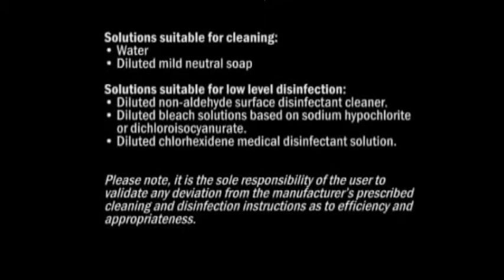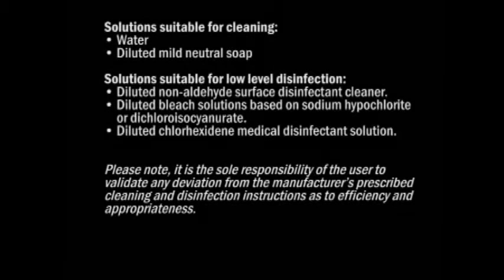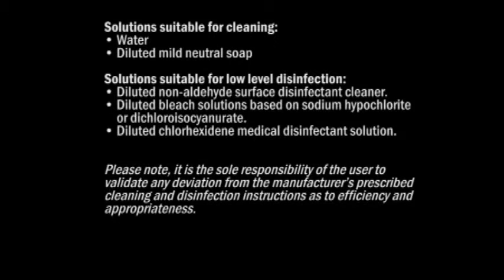Solutions suitable for low-level disinfection: diluted non-aldehyde surface disinfectant cleaner, diluted bleach solutions based on sodium hypochlorite or dichloroisocyanurate, diluted chlorhexidine medical disinfectant solution. Please note, it is the sole responsibility of the user to validate any deviation from the manufacturer's prescribed cleaning and disinfection instructions as to efficiency and appropriateness.